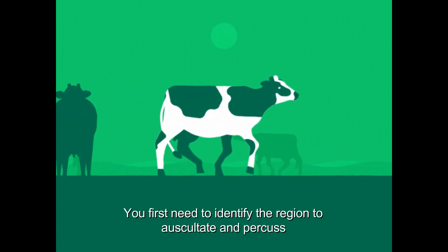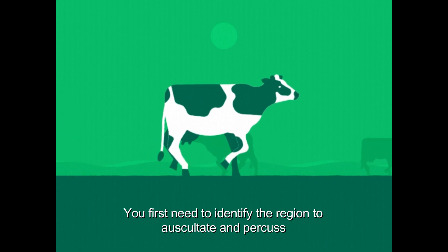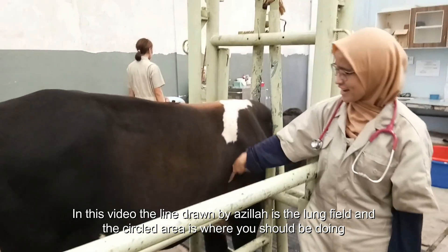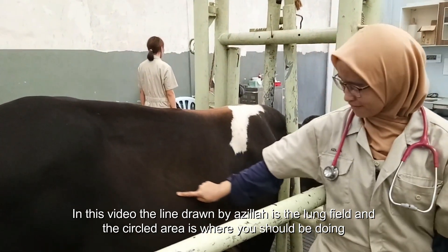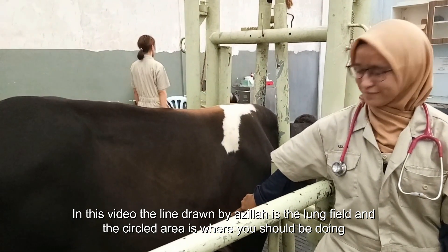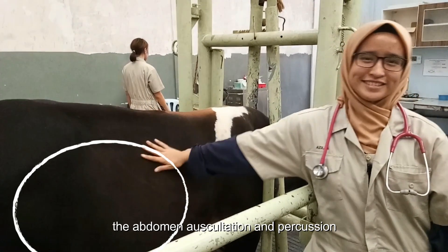You first need to identify the region to auscultate and percuss. In this video, the line drawn by Azila is the lung field and the circled area is where you should be doing the abdomen auscultation and percussion.